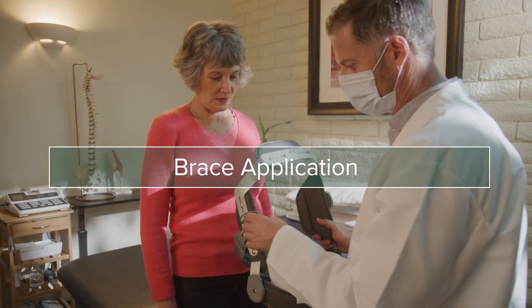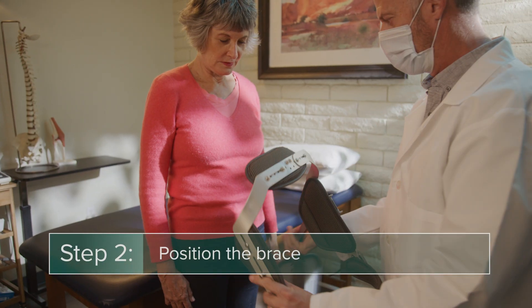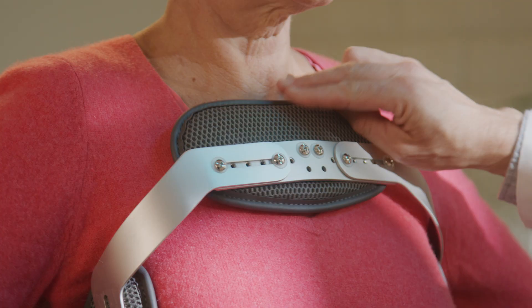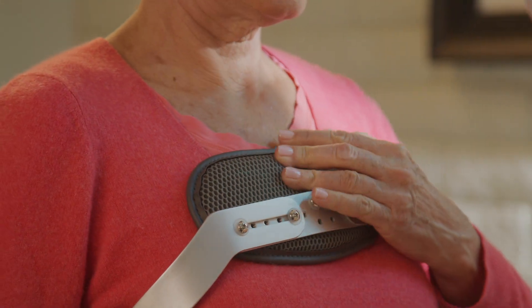To apply the brace, start by detaching the clip from the frame and opening the lever latch. Next, position the brace over the torso. The top of the brace should be about two finger widths down from the sternal notch, the visible dip in between the collarbones.